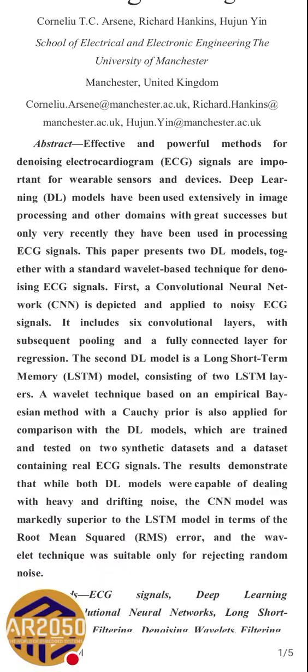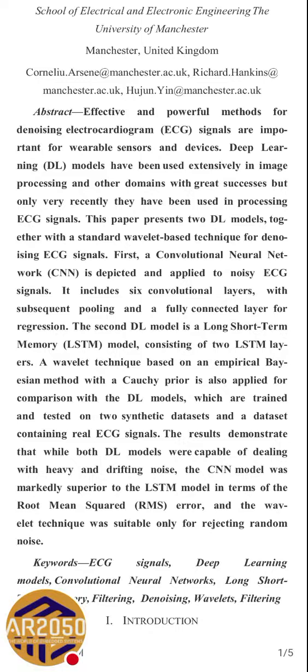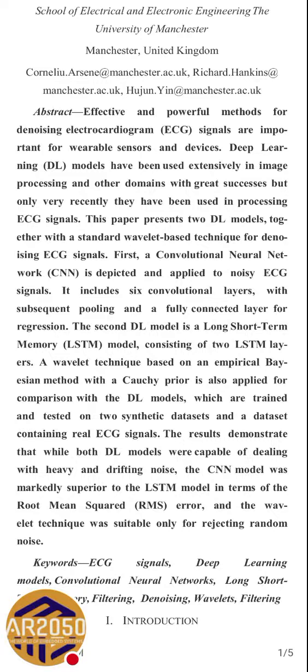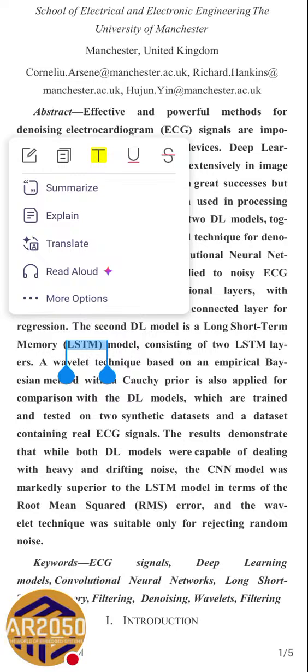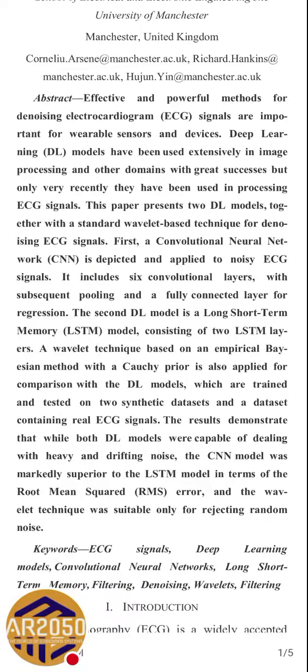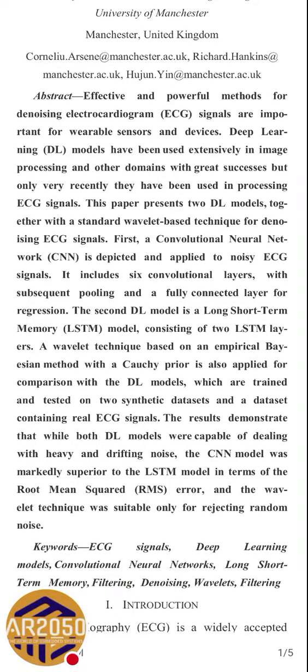Anyways, this paper basically models two deep learning models. First is a convolutional neural network, a CNN, and the second one is based on the LSTM. CNN is applied to a noisy ECG signal, and it includes six convolution layers.